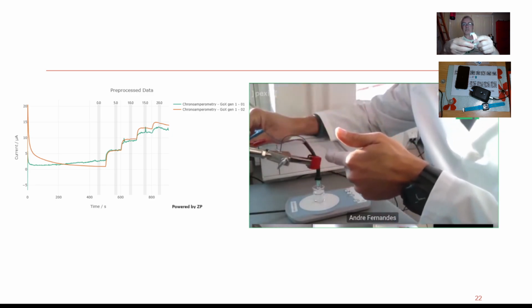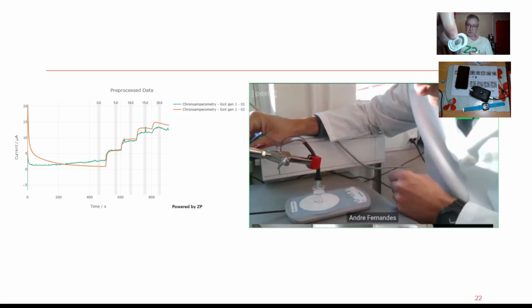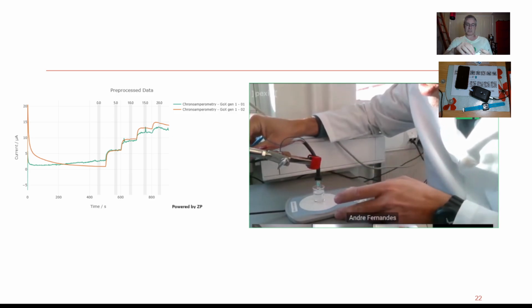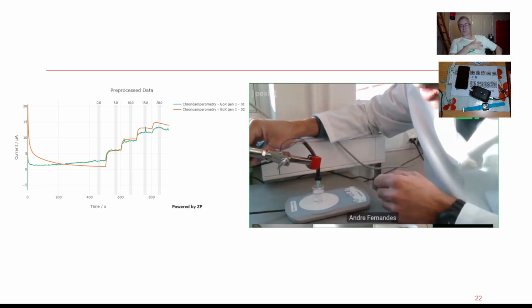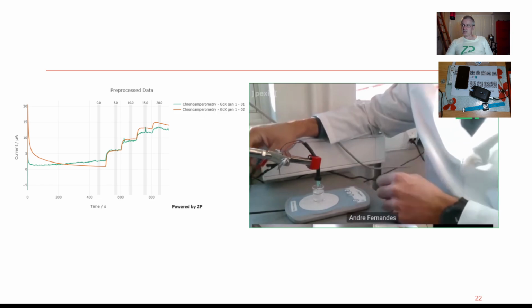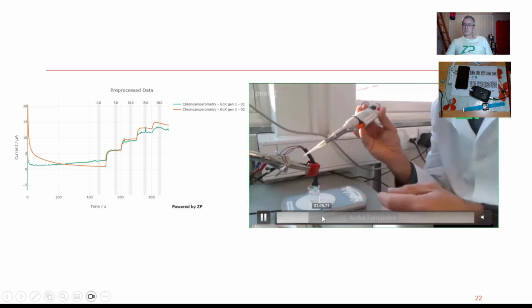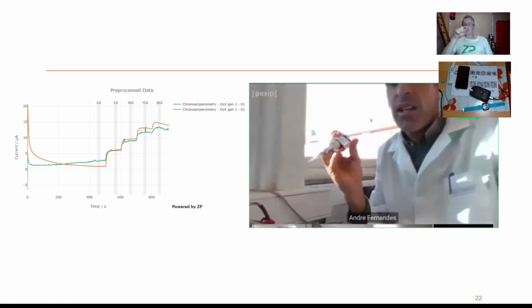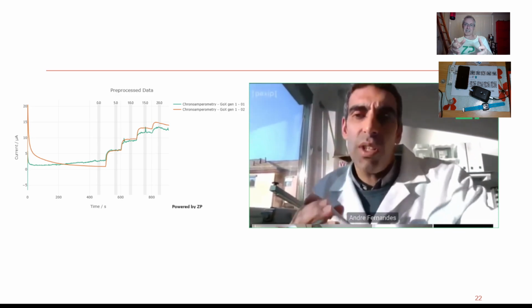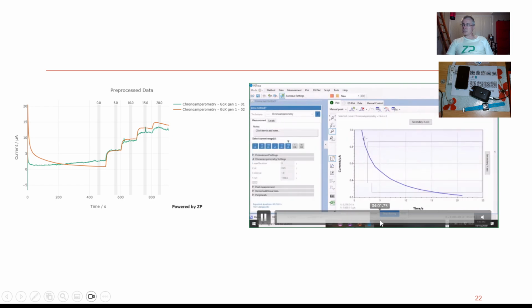So if I flip this out, there's a very expensive to produce microneedle system here. But Andre is setting up a sort of lower cost CGM type experiment here, and he's going to put those sensors into that solution. I'm going to fast forward a little bit because he's talking about the setup. You kind of need to do this experiment and get this data before you then bring your microneedles in, because you have to baseline yourself and say, is this rig even really working? So this was actually a live demo that Andre was doing for a client.